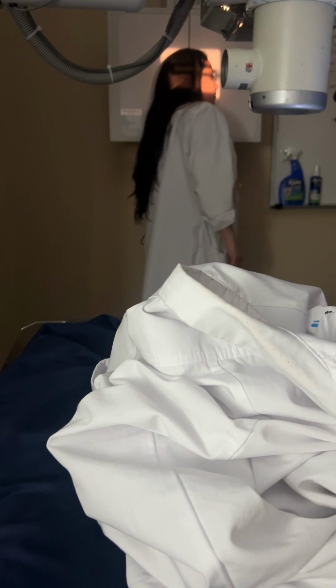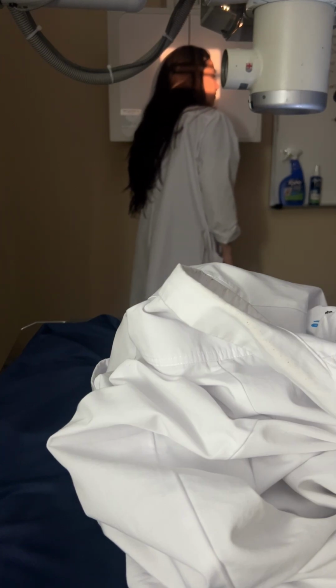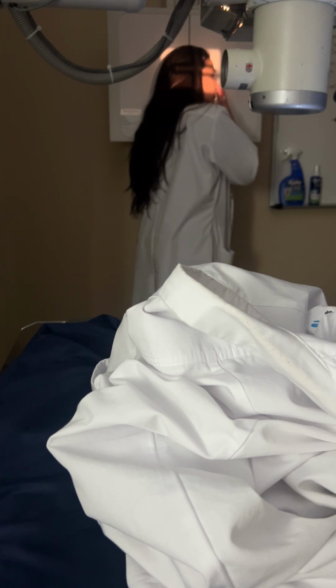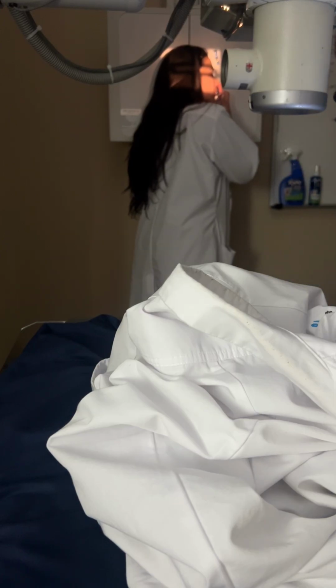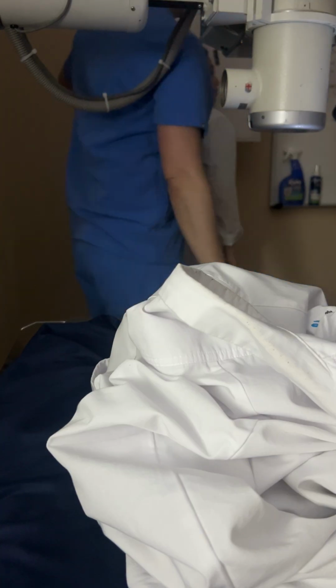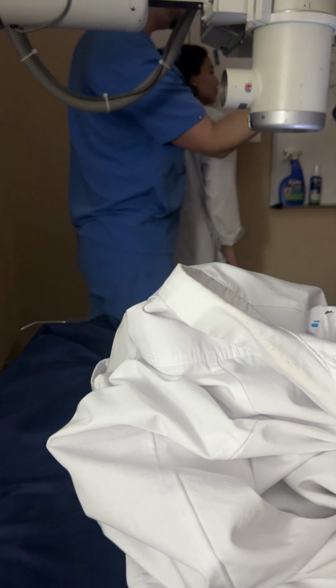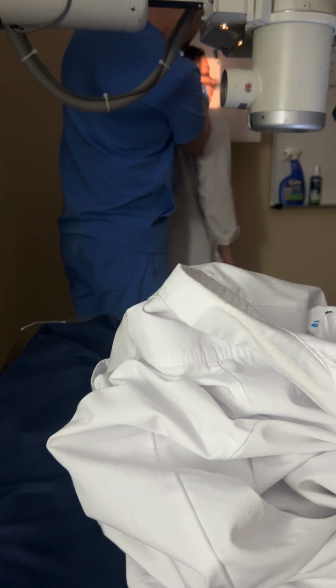And what is your CR centering for the lateral of the facial bones? At the top of the nose, where the nose and eyes meet. Right, whatever this is right here. Midway between the outer canthus and the... it's right here. So what we want to do is find her outer canthus and her EAM, and we're going to go halfway on her zygomatic bone.